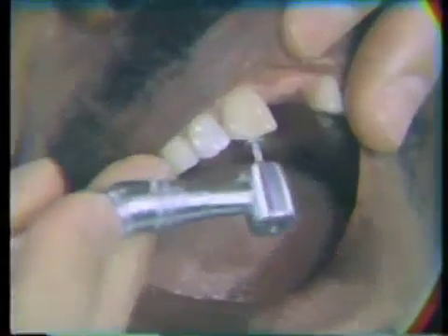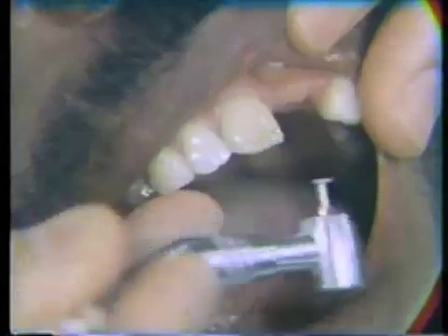I'd like to show you the radiograph. You'll note that the tooth has been filled with gutta percha. We will make a post hole two-thirds the length of the root. We'd like to start now by reducing the tooth until we have sufficient tooth structure left to make a direct core.